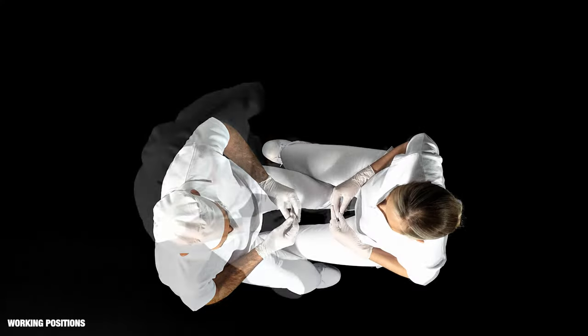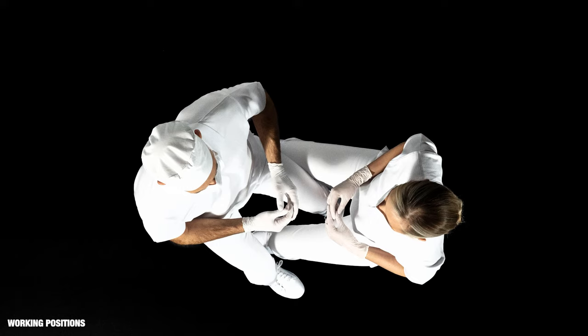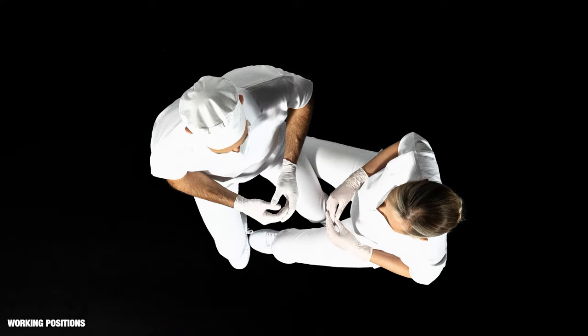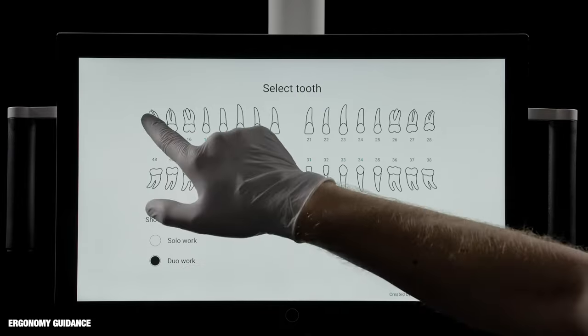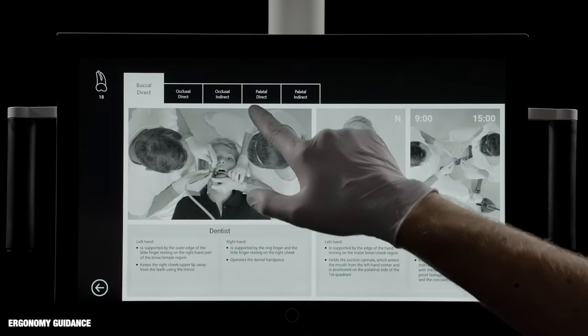To see all surfaces of all teeth while sitting well, the operators should sit in four different working positions, and the patient's head should be placed in six different positions.